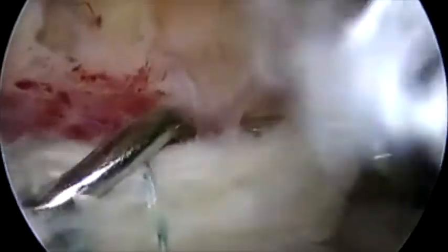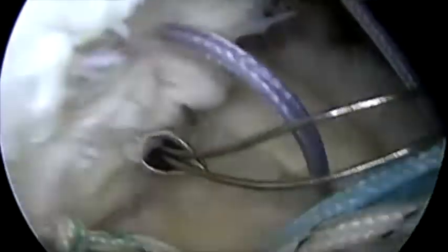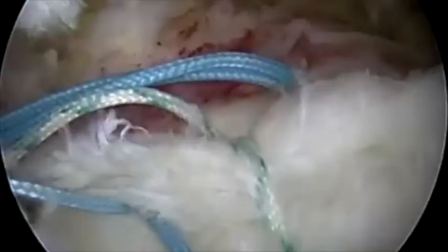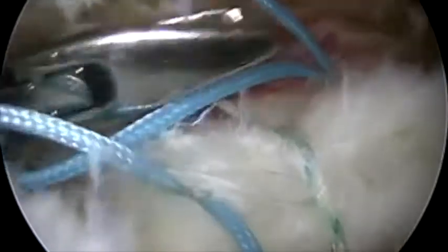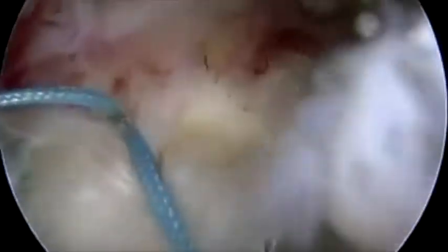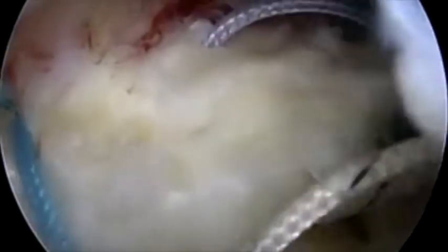The arthroscope is placed in the lateral portal and after punching, a second anchor is placed laterally in the greater tuberosity. A curved suture hook is used to retrieve all three limbs of suture sequentially. The loop is retrieved and through it a suture grasped. This creates a locking stitch which provides excellent resistance to suture pull through.